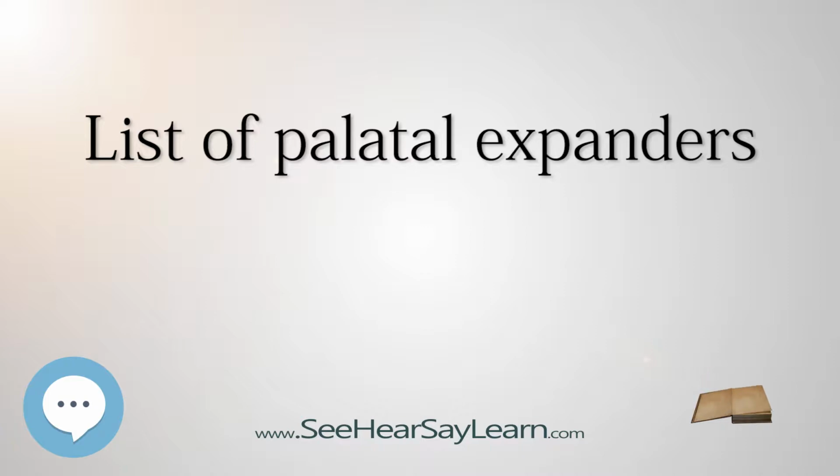These types are: 1. Tissue-borne, 2. Tooth-borne, 3. Slow maxillary expansion type, 4. Rapid maxillary expansion type, 5. Bone-anchored type. Types of expanders. Tissue-borne expander.